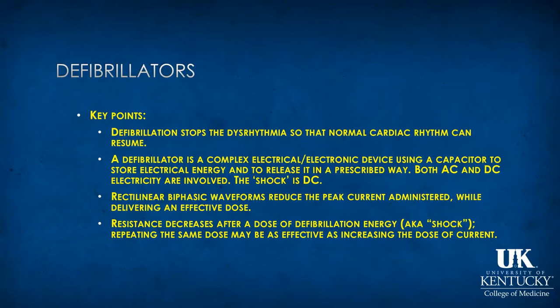And if you remember that current is equal to injury or damage, however, this is a controlled amount of electrical energy delivered in the form of current.